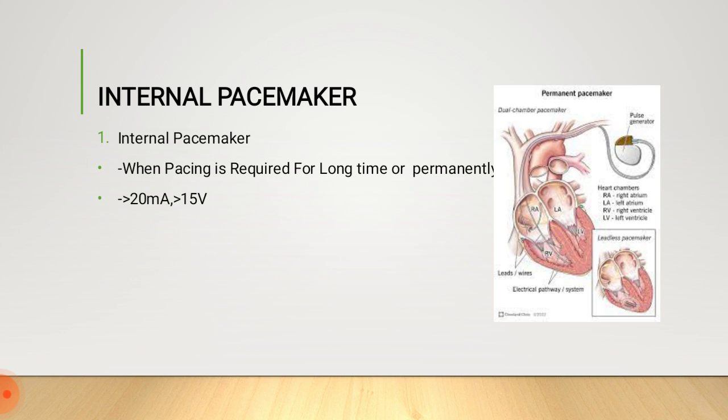In an internal pacemaker, 20 milliampere current and 15 volt source is required. Compared to the external pacemaker, it requires a minimum amount of current source because the pacemaker is placed near to the human heart.